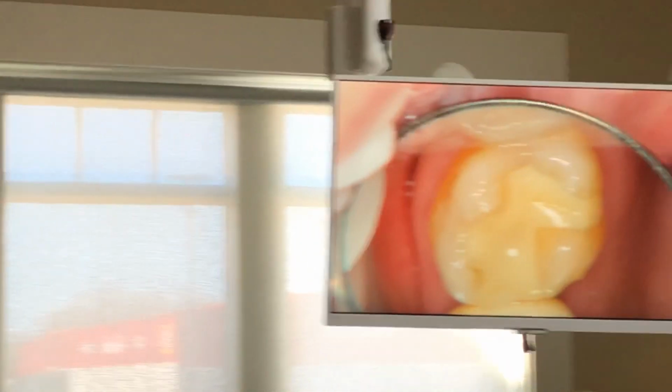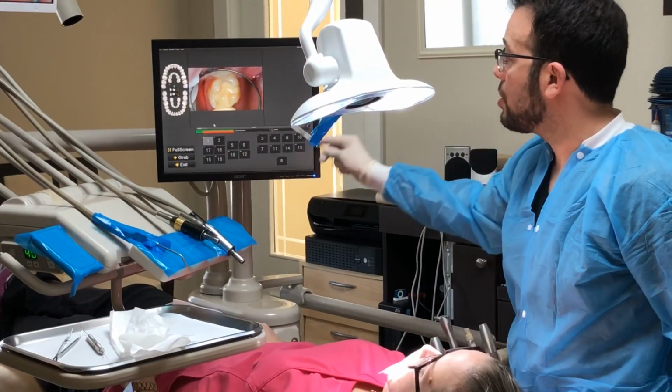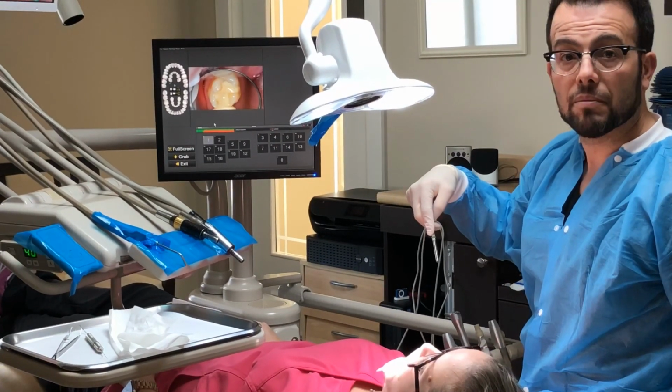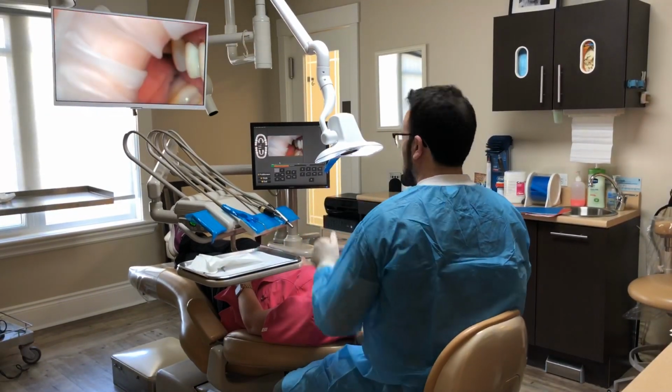And if you want to show here, you have also the ELIO X connected to your image capture software, whatever software you use, and I can capture this image directly in the patient's file. Okay? So let's look at the next function.